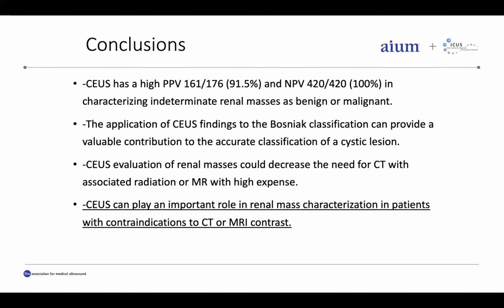What's really important is our negative predictive value has been 100%. We have followed over 1,000 lesions now for 10 years. None of them have converted to cancer. They may have grown or they may have changed, but they are still benign.